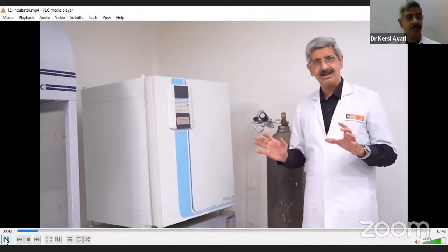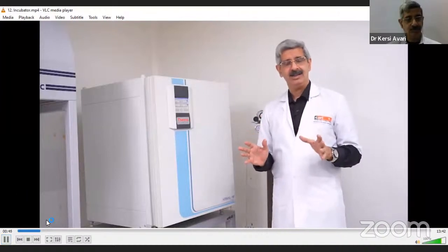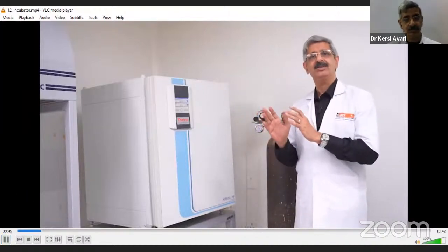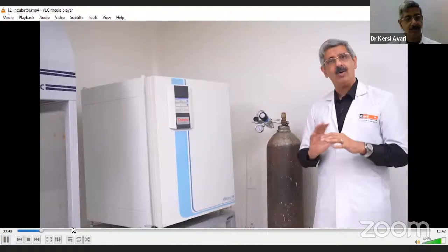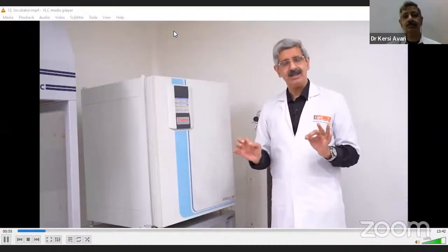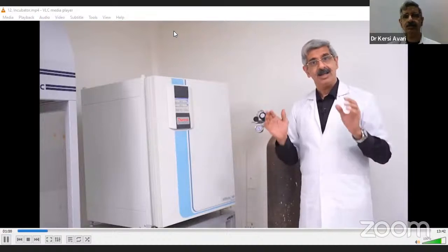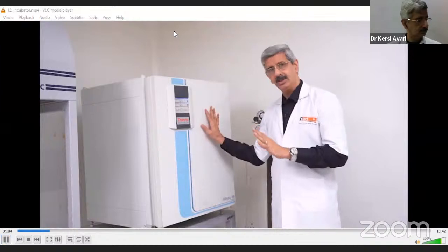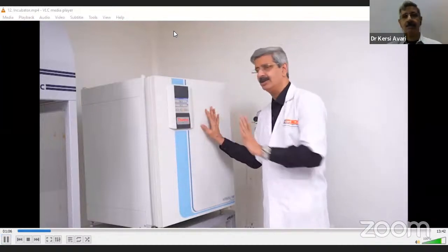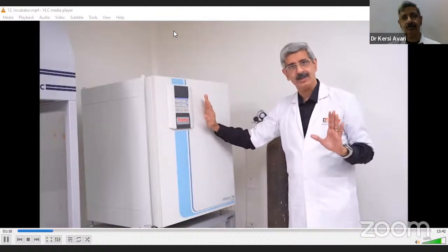So the gametes or your embryos in a well equilibrated media, under all these 3 conditions, all amalgamated together, is the ideal incubation environment. Atraumatic, stress-free, pH friendly. Now, how is it maintained as such? This unit, the display unit, will show you the temperature and the CO2.